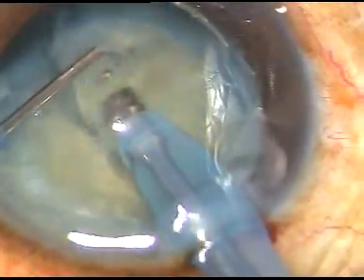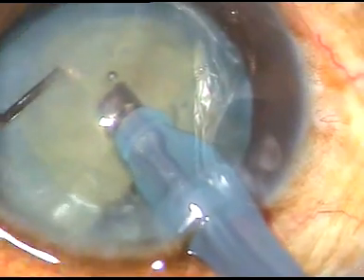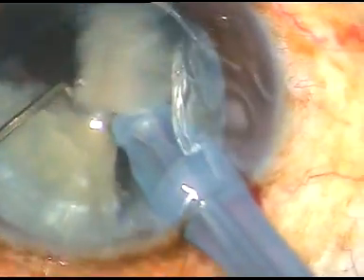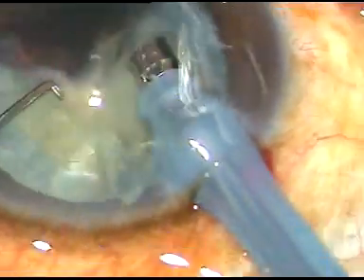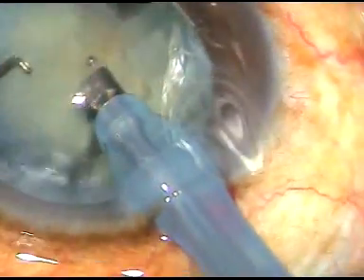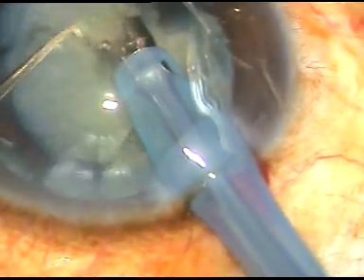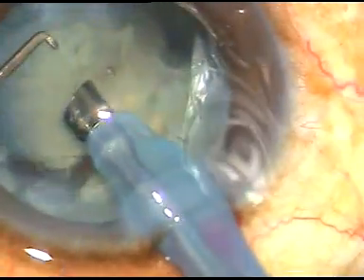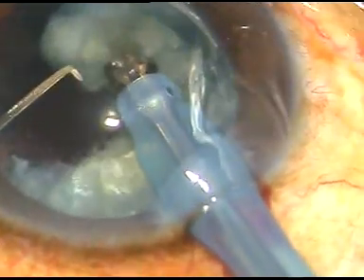This is a very small chopper. I call it a micro chopper. It is just a modified Sinskey hook. Sinskey is very thin and very fine. It is just a little thicker than a Sinskey hook, but it is very small, about 0.5 millimeter long at the end.